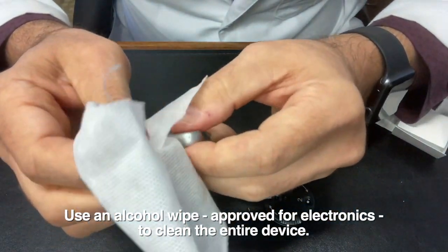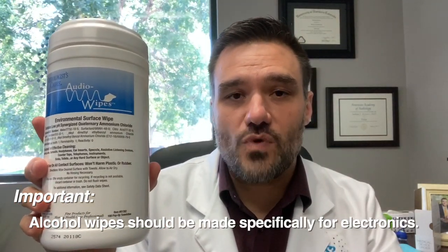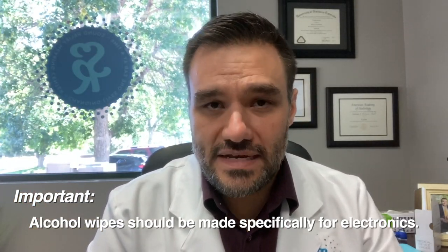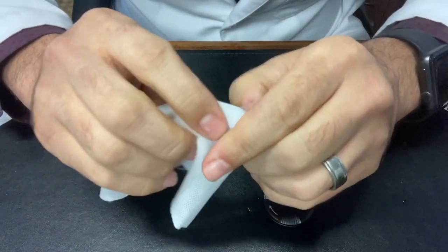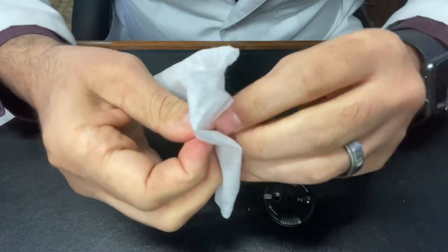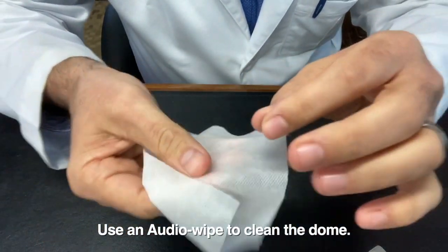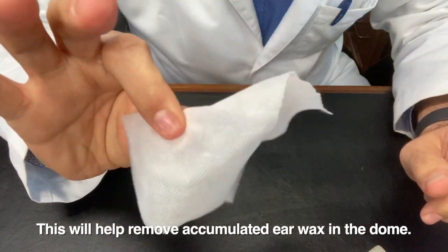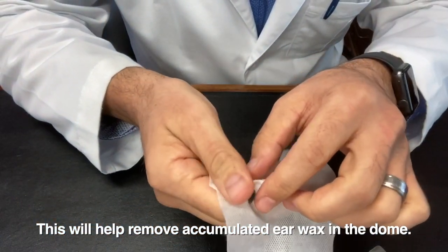Once I've replaced the wax filter, I like to just give this whole thing a wipe down. Here at Sound Relief, we use audio wipes, which are specifically designed for devices. You can use an alcohol prep wipe in a pinch, but it is recommended that you use audio wipes if possible — they're designed specifically for electronics. I also want to clean this dome. I can take this dome and put it in the audio wipe or alcohol prep wipe, just like that, and just mash it around. That'll clean out any wax that has accumulated in the dome itself.